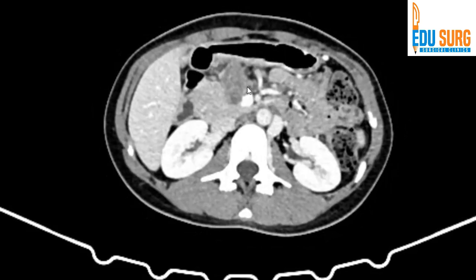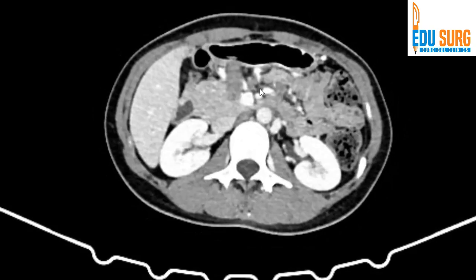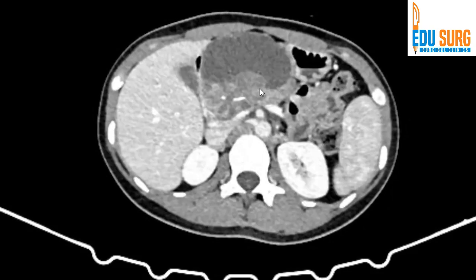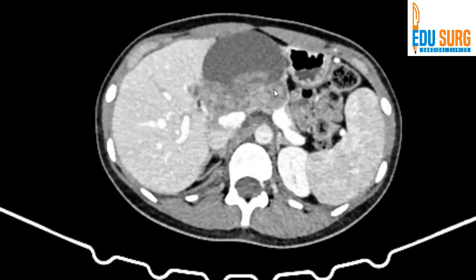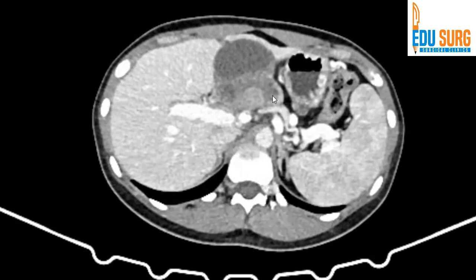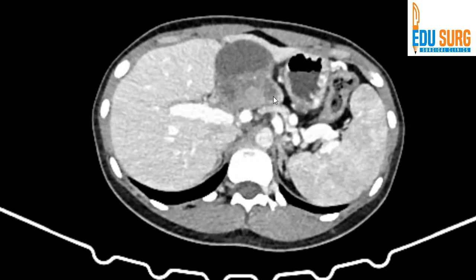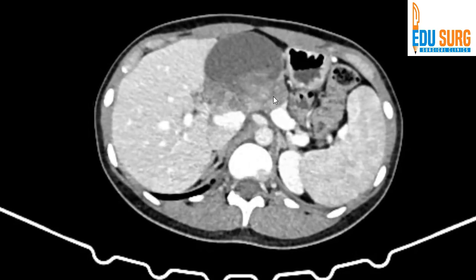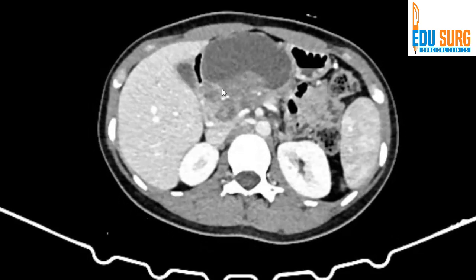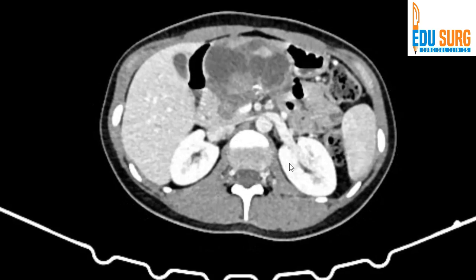SPENs usually present on one of two sides: if it is on the left of the portal-SMV junction, we do a distal pancreatectomy; if it's on the right, then you do a Whipple or a central pancreatectomy. But here, if you can see, beyond the tumor there is no pancreas — the pancreas is getting over. So most of the pancreas is involved by the tumor, and there is splenic vein thrombosis.